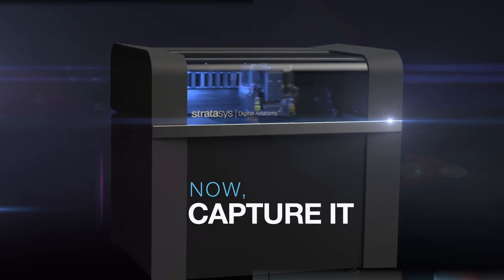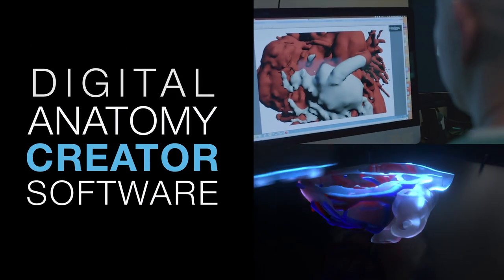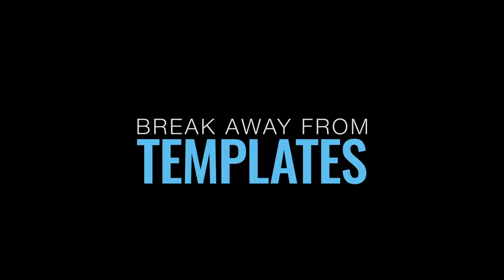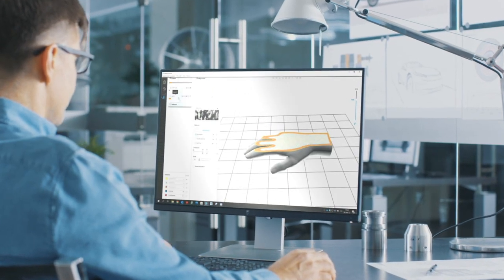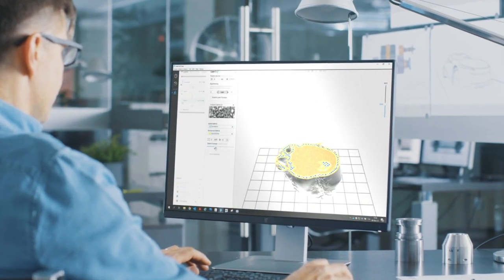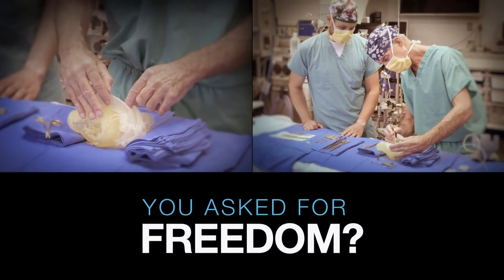Introducing the Digital Anatomy Creator Software by Stratasys. Break away from the templates. Take control and explore. Calibrate each layer to your precise specifications. You asked for freedom. Now it's yours.